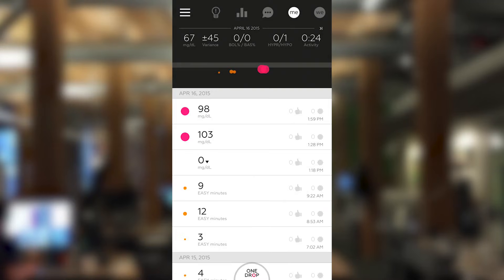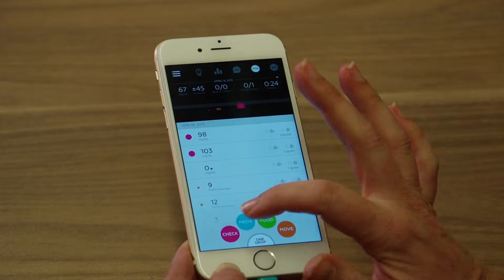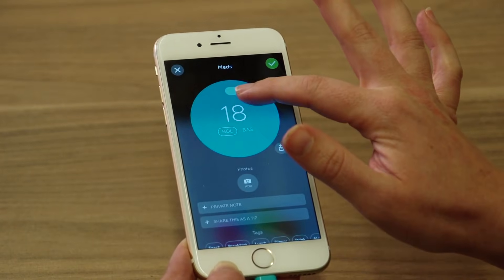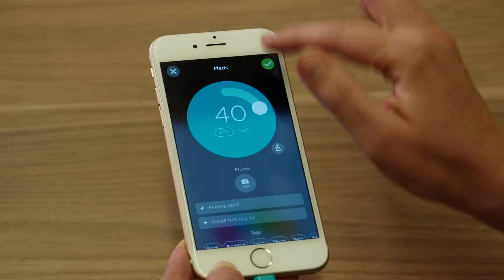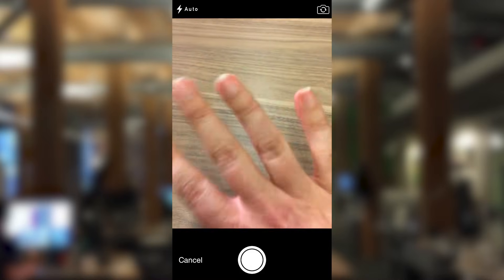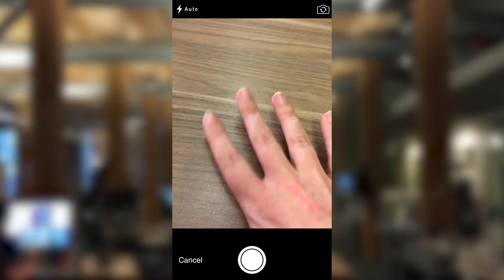We save that information and you can see that it tracks at different points in time what a diabetic might need to know about themselves, so you can track over time. You can also log medications and how your body's interacting with that. You can also track food, and one of the ways you do that is you can take a picture of your food — we're just going to use my hand as if it's food.